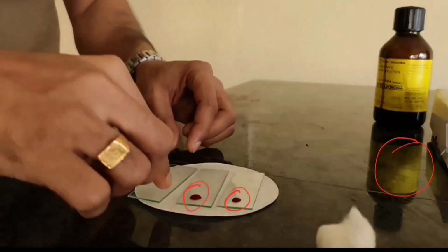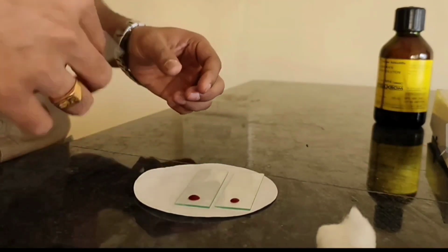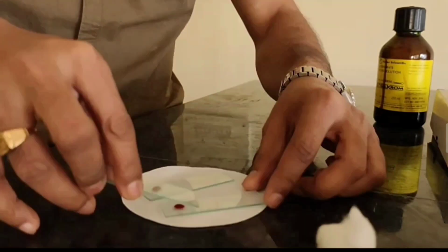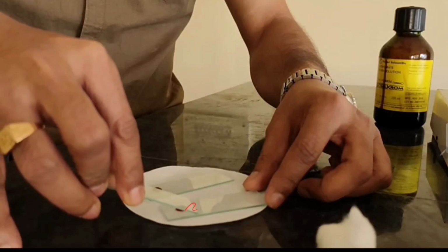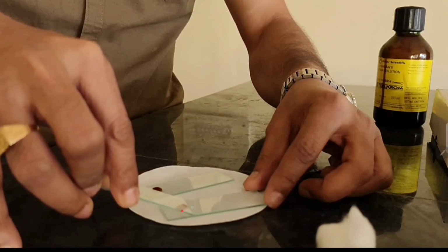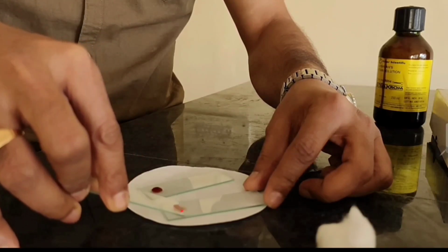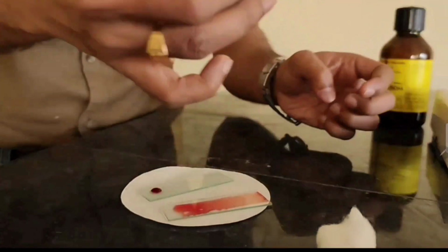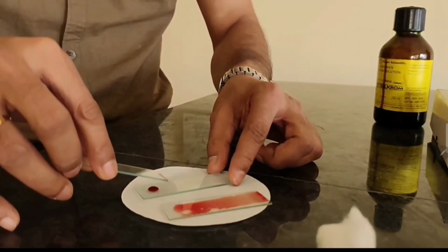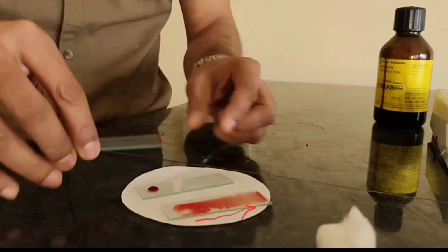And now we are going to use a spreader. So let's see how we can use the spreader. The spreader should be in front. You must check that your spreader has a smooth margin and is in front of the blood drop. So the blood drop is here, and putting the spreader here and pulling backward, the blood will spread throughout the margin. See, the blood is going to spread throughout the margin, and in one go we have to spread this whole slide.